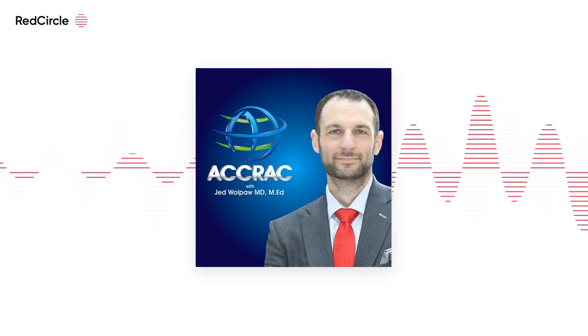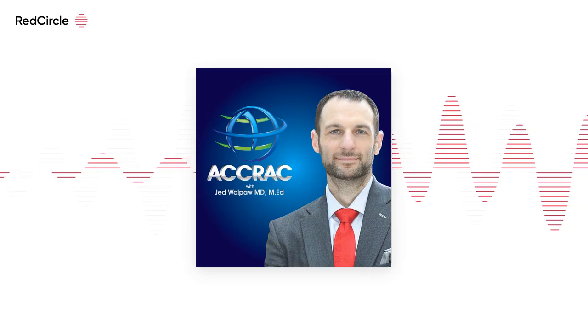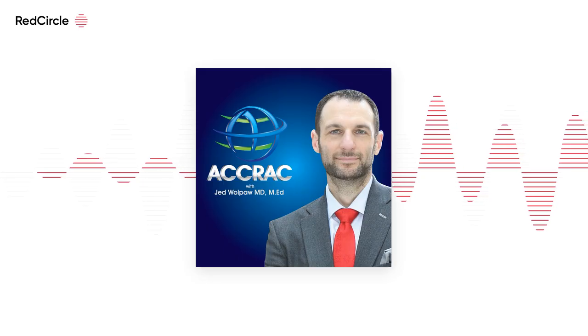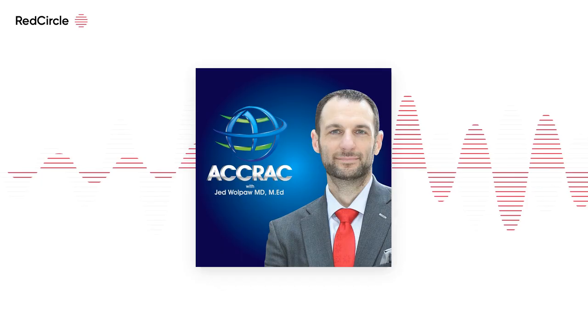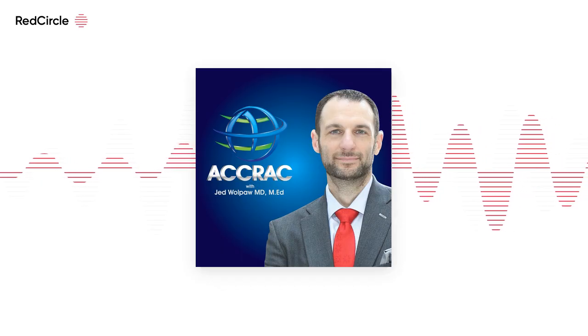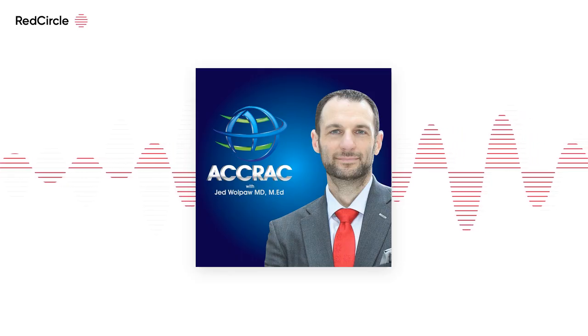Either way, you're looking for... Again, if you're using pressure control, you can go by tidal volume essentially. But if you want to be quite specific to this protocol, you would calculate respiratory system compliance, which requires a plateau maneuver regardless of what mode you're using. Plateau minus PEEP again, and then the tidal volume that you're seeing ventilated.